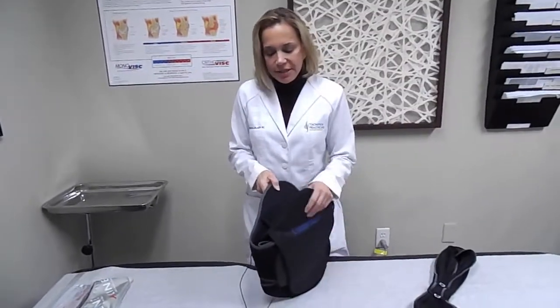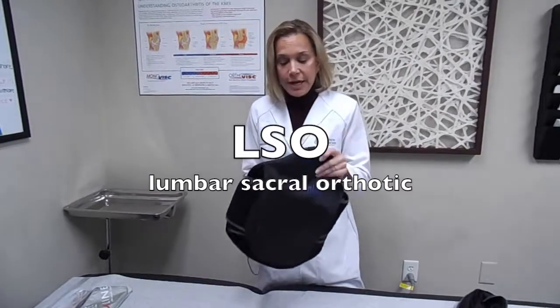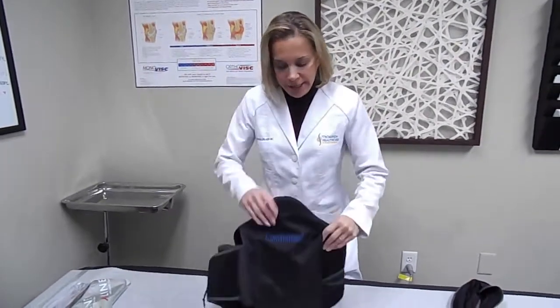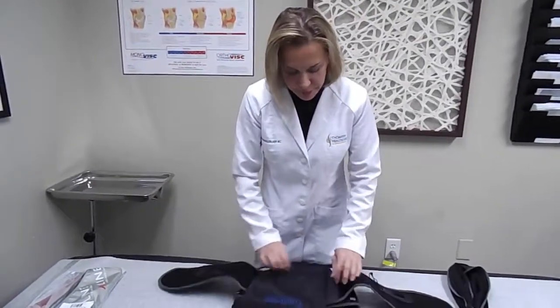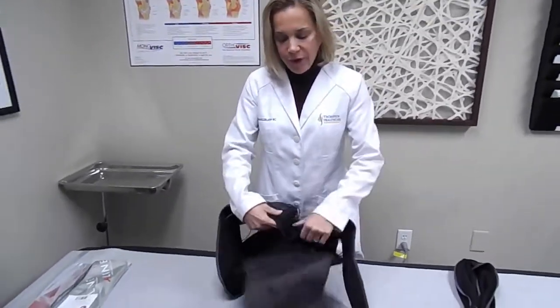Next, I'd like to discuss the back brace, better known as the LSO. That stands for Lumbar Sacral Orthotic. This is something that can help add to the stability of the lower back as well as help with pain. It can be worn in a full stature such as this, or it can be broken down to a belt. The belt provides a little bit of traction that helps add to the support and help decrease the lower back pain that you may be experiencing.